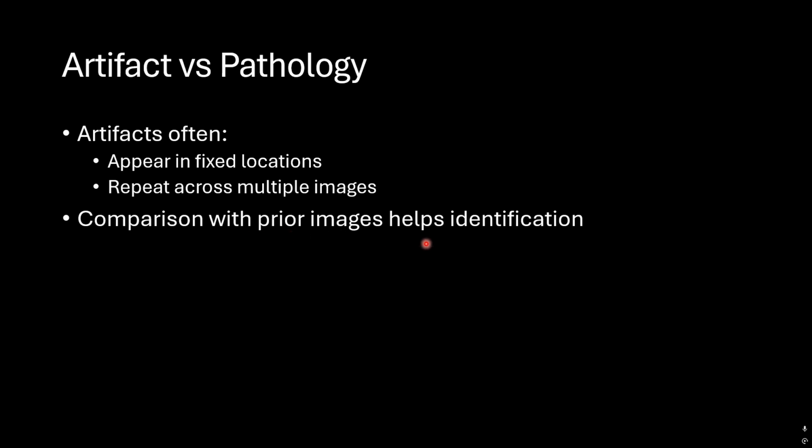Comparison with prior images helps the identification. This is why if we see something unusual in the image, we need to check previous images to make sure that this is a pathology, not an artifact.